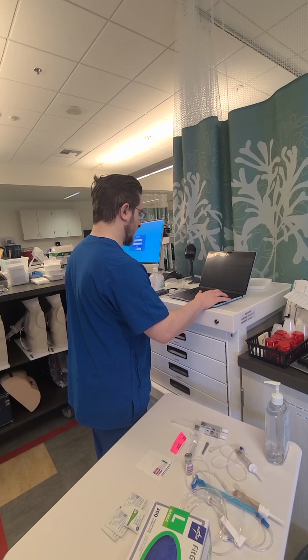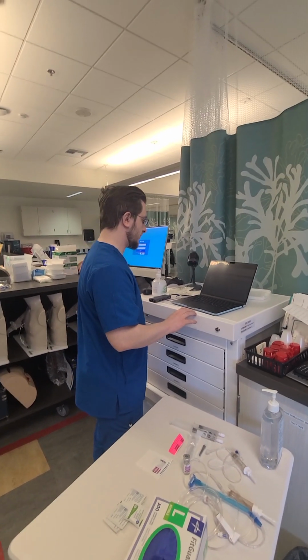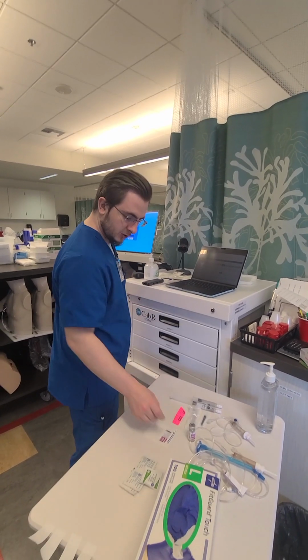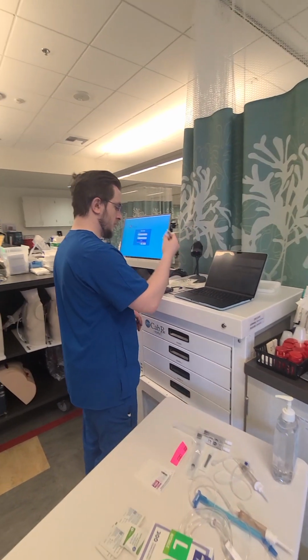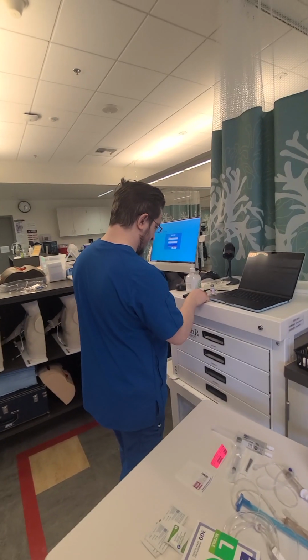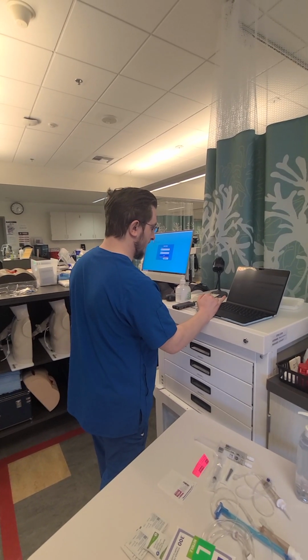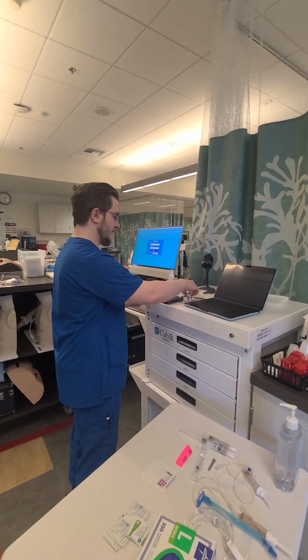And then I'm going to get also ondansetron, Zofran, which is 4 milligrams, PRN IV push, and it is 2 milligrams to 1 milliliter. So we will be drawing up 2 milliliters. And the vial is 40 milligrams for every 20 milliliters. So for 4 milligrams, we only need 2 milliliters, which will be 4 milligrams of medication. So I've got all of my meds.